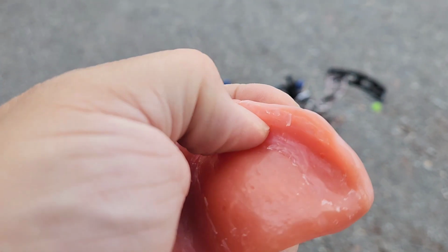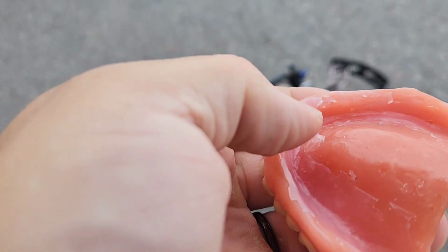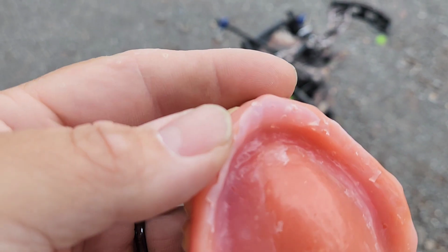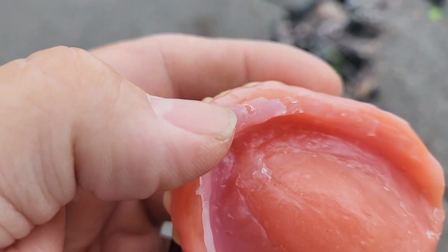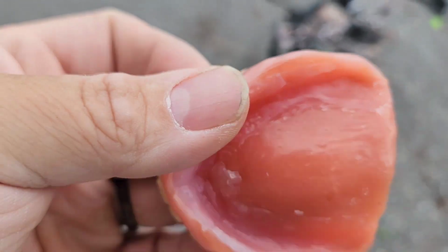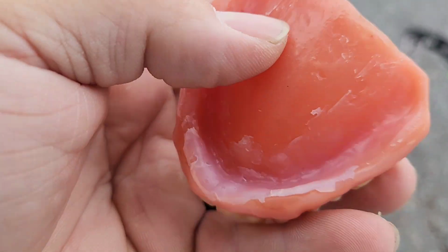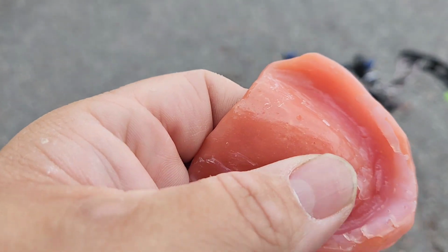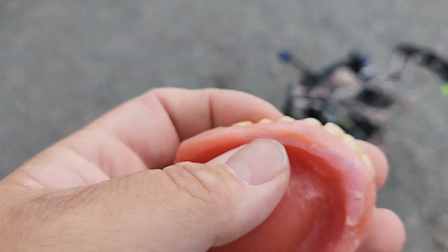Another thing I don't like about it is you get these little weird air pockets. That's one thing I don't really like about the DenSureFit, you get these little bubbles. See that little bubble right here? They'll fill up with saliva and bacteria and all that kind of stuff, and if you don't keep them clean, it could cause you some issues down the road.